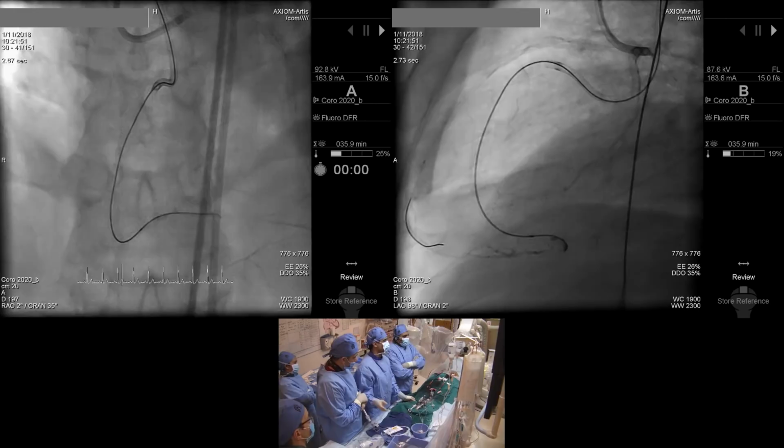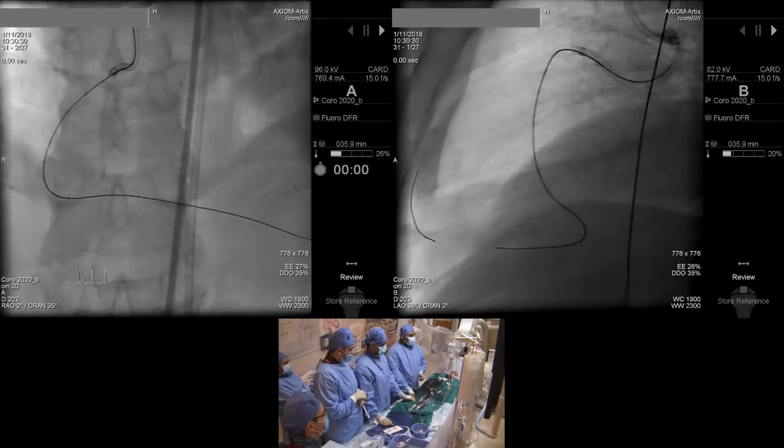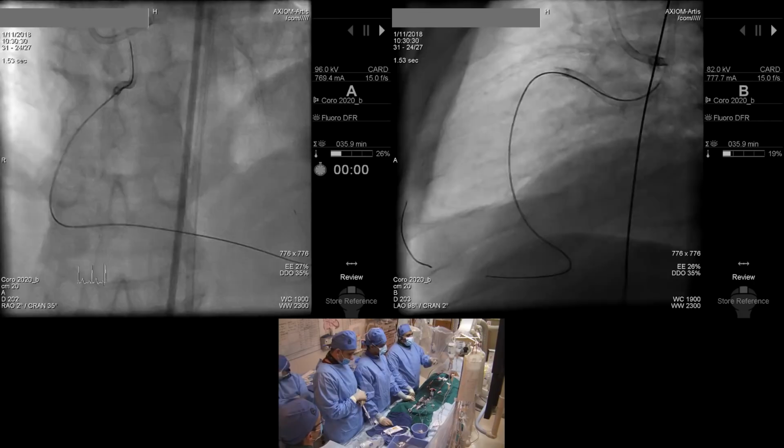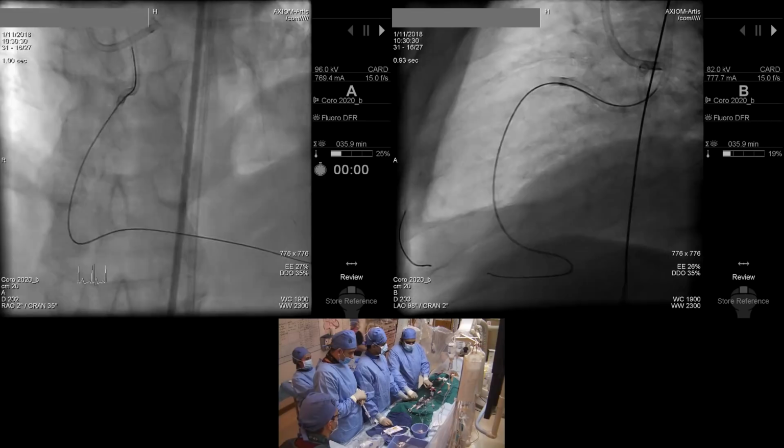So we are here now. I will show you. Our wire is here now. The microcatheter is stopping in this part, in the big calcium burden near the crux. So I believe I will do a small balloon inflation in the mid segment RCA, and we check with IVUS, and then if everything is good, we are true lumen, we change and we dilate. So what do you think? Excellent.